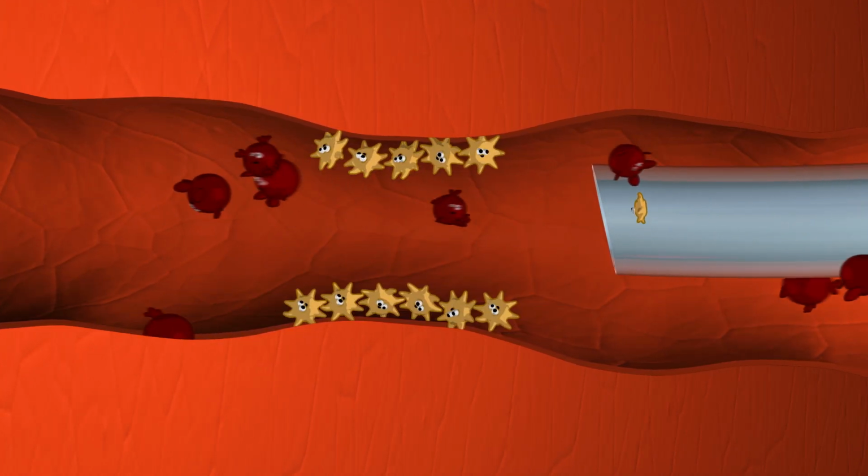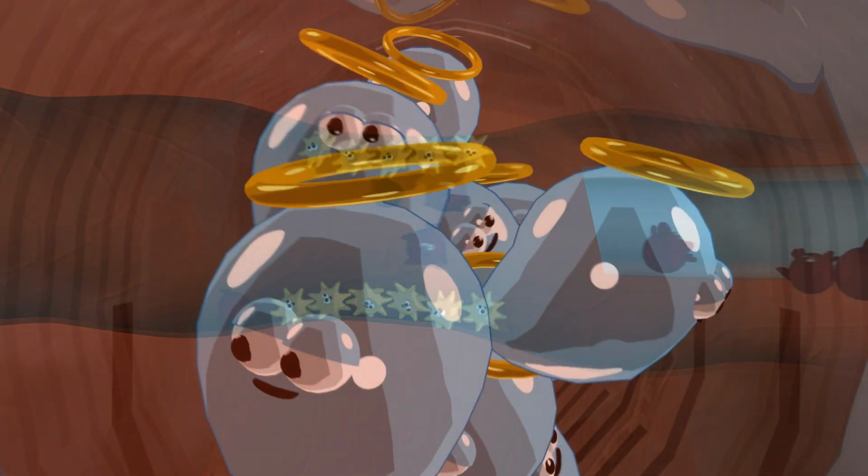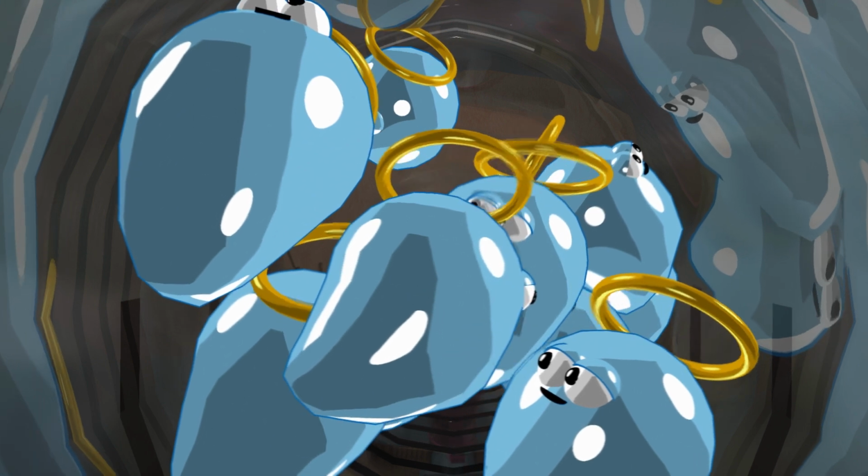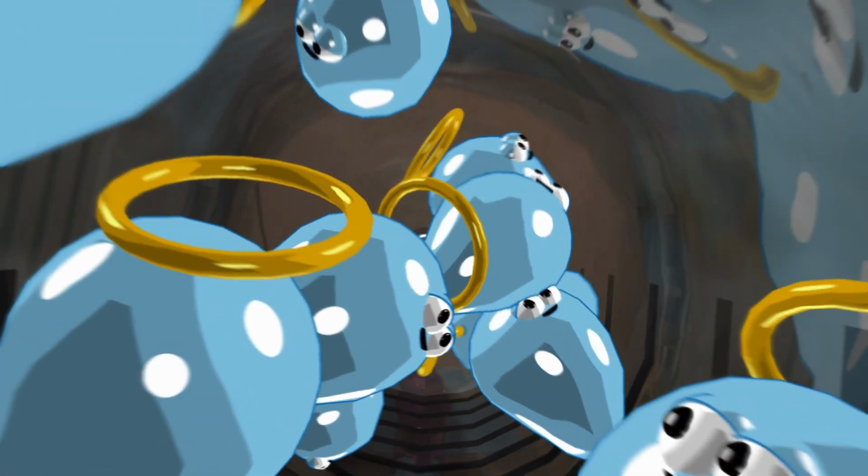With this knowledge of the potentially adverse physiological response to high-pressure flushing or infusion, we hypothesize that the optimal flushing or infusion should mimic the rate of blood flow similar to that of the patient.